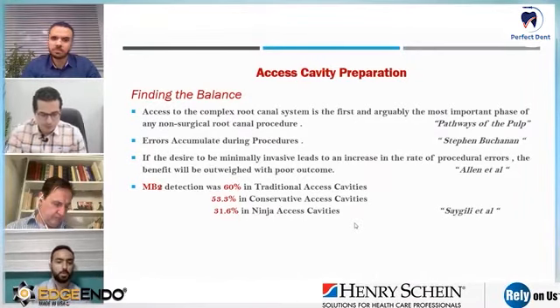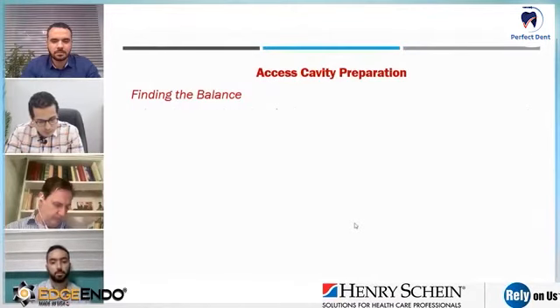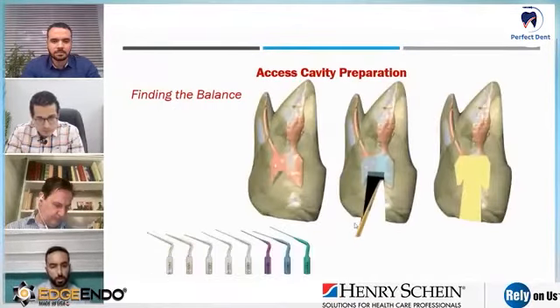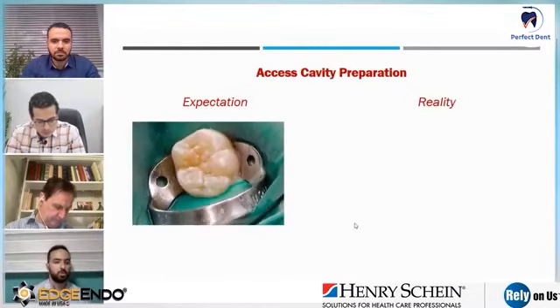You need proper flexible rotary files with high cyclic fatigue strength, and that can be pre-curved to enter such curvatures in a tight access cavity design. And finally, you should have proper ultrasonic instruments and proper experience on how to clean the pulp chamber properly from pulp tissues if you're going through with a conservative access cavity design. How often do we usually have this option?